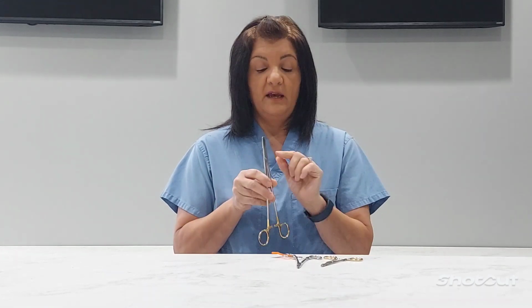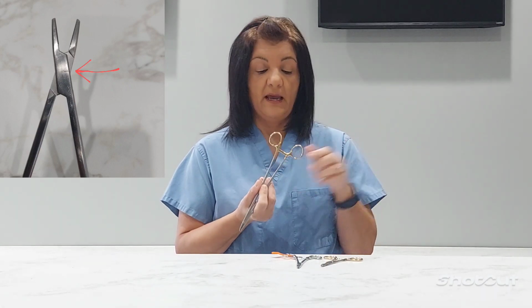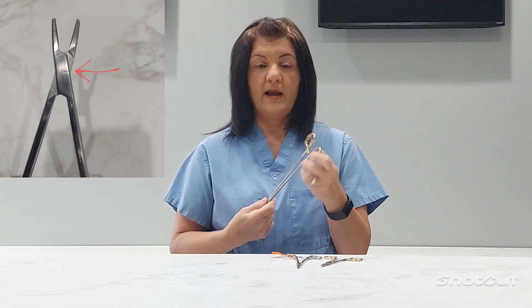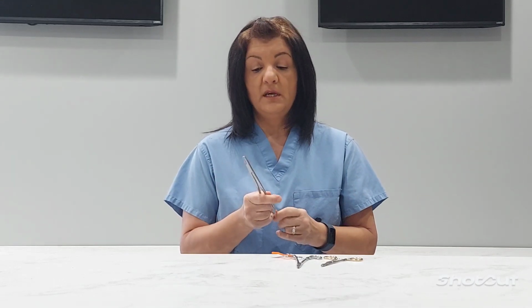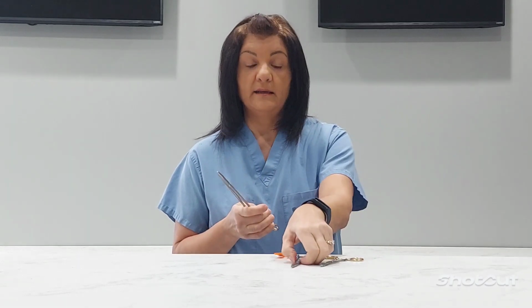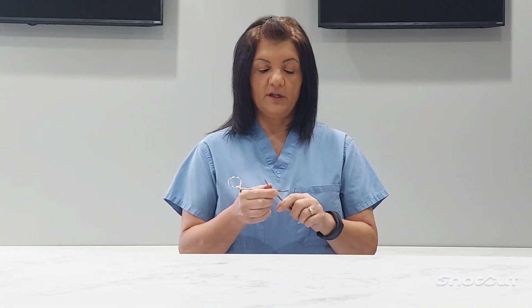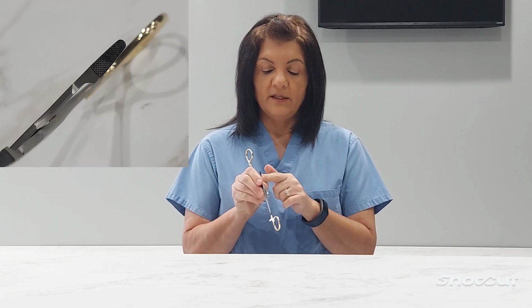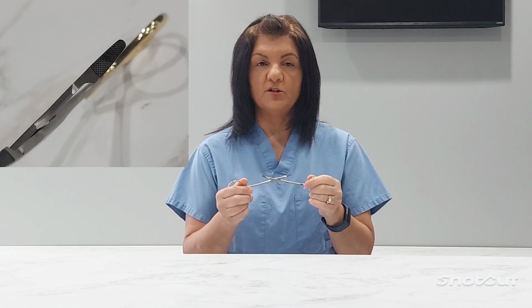This particular one happens to have a crack in it, which I will insert a photo of so that you can get a close-up look. And you can also do the ratchet test that we did with the hemostat. Same thing, put it on the first ratchet and give it a whack. This does not pop open, however, this instrument has a crack and some other cracks on here. So that's going to deem it not usable. Another item I wanted to point out, which I'll put another inserted picture of, is that this is a good example of bioburden. There's black on these pads. So I'll put a picture of that so you can see what bioburden on these instruments looks like.